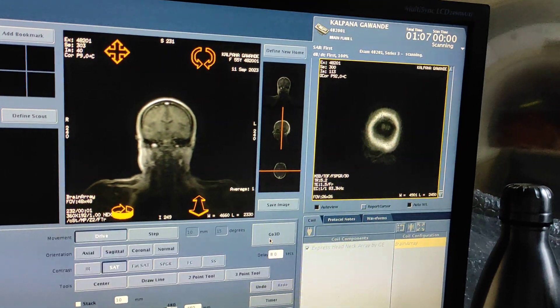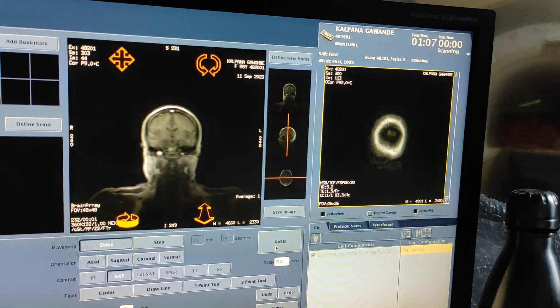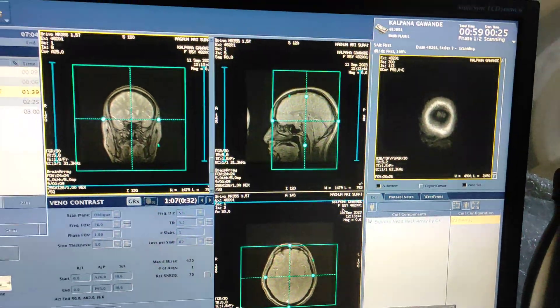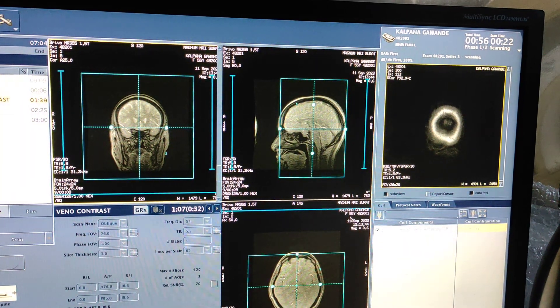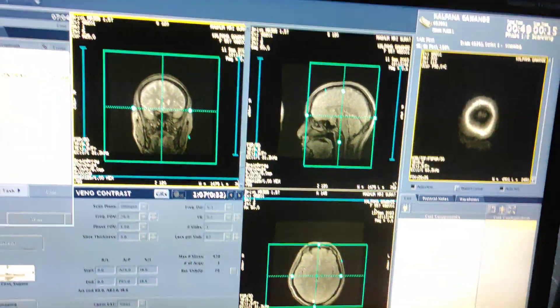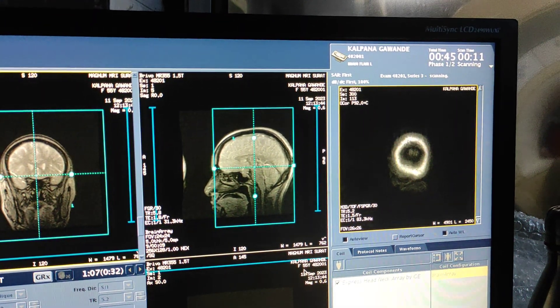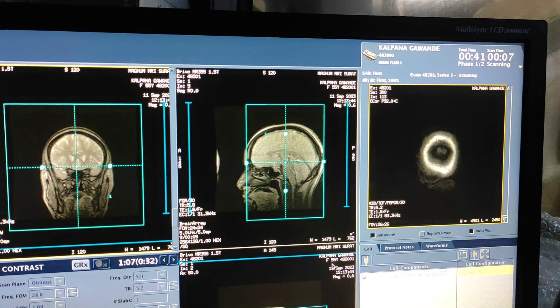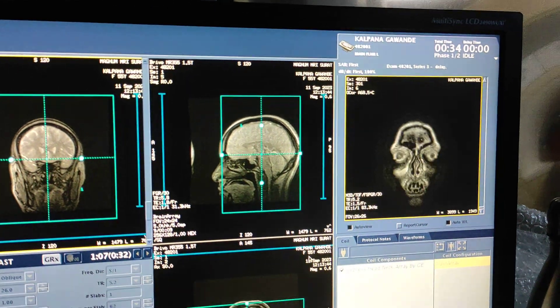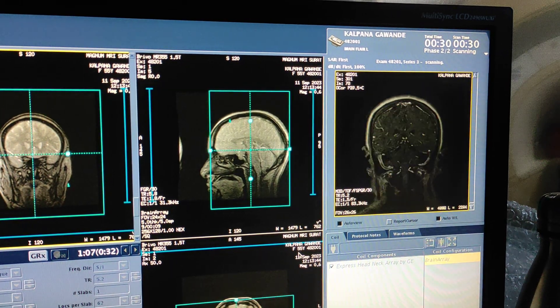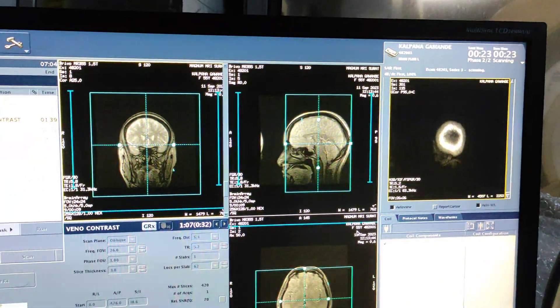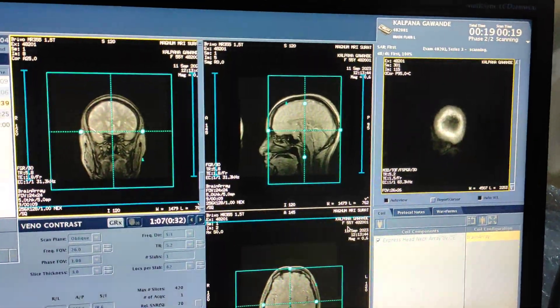Now I will ask that person to push the contrast. As soon as he started contrast, I clicked on the scan. The first phase will be arterial and the second phase will be a delayed contrast for sinuses. I am taking only two phases here. This is the first arterial phase. This is almost venous — contrast is there, but mostly arterial plus venous. The true venous will come in the next phase.